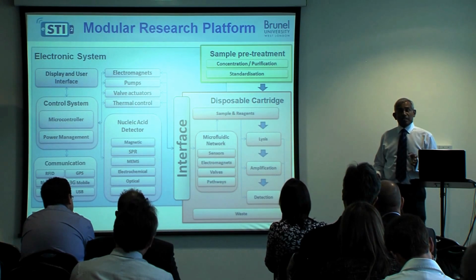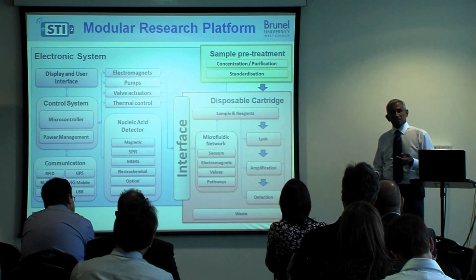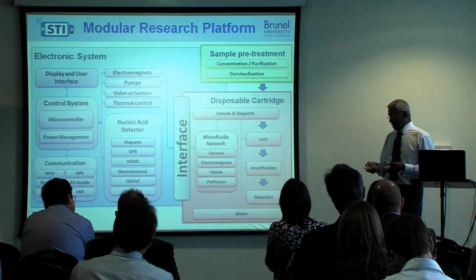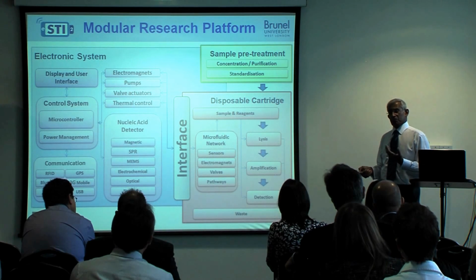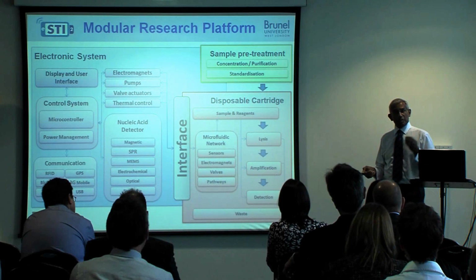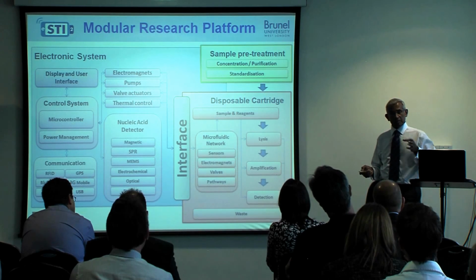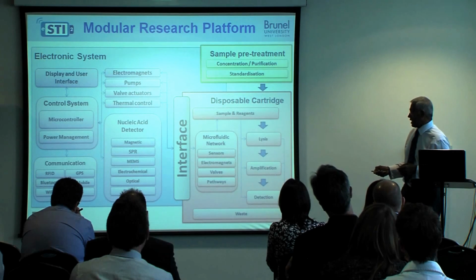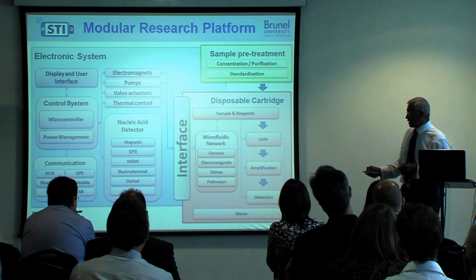The trend now is not only just single pathogen detection, you need to detect multiple pathogens. So there are debates in terms of whether you should use a single sort of system or a parallel sort of system to detect multiple pathogens. That debate is going on because there are some restrictions associated with the amplification side of things.